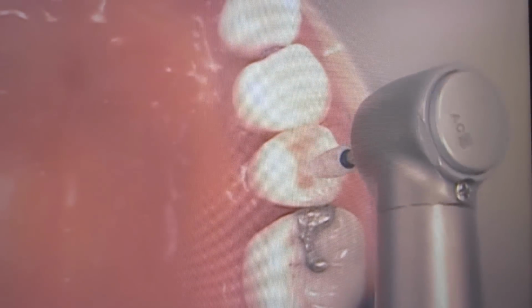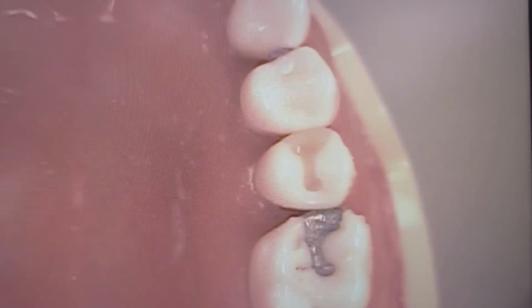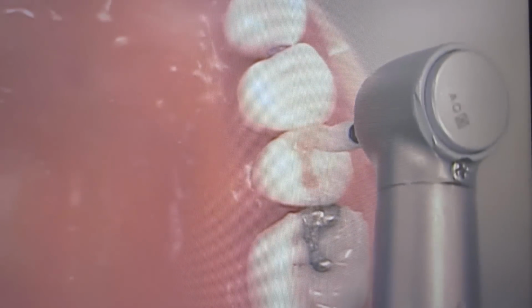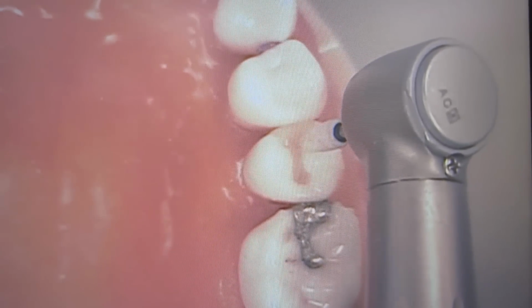Now we're doing the finishing process. If you do everything correctly, you should not have to do this step. But right now we're using the white stone to smooth out the margins.